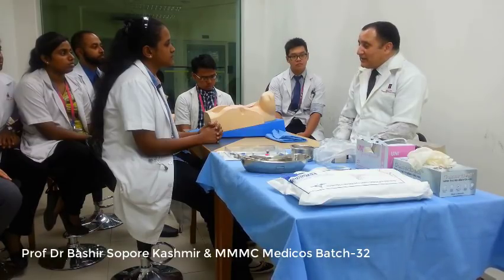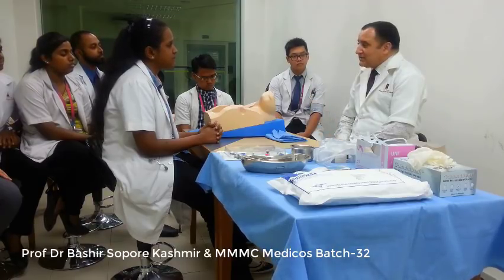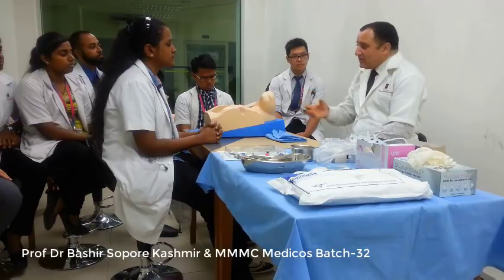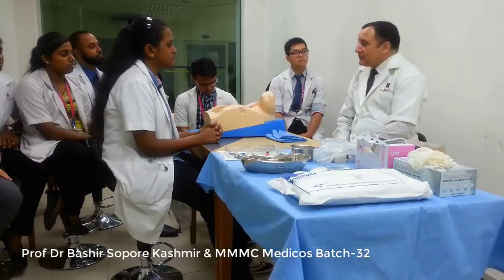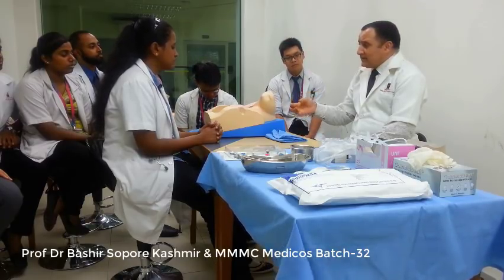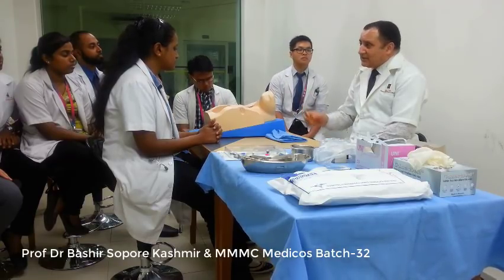Another important indication of central venous catheterization is when we have to do transvenous pacing. When we have to insert transvenous pacemakers to pace the heart, then this is the route we have to choose.